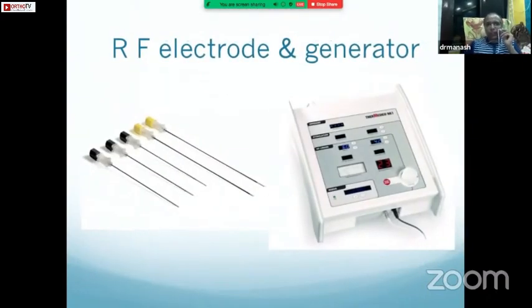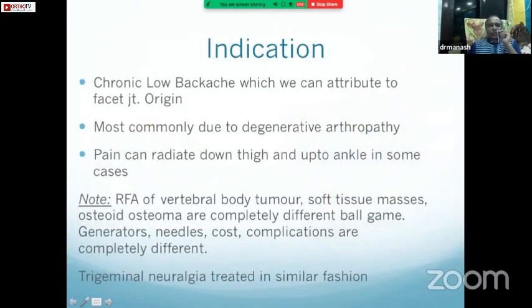So these are the normal needles for the radiofrequency ablations. These are either 22 or 20 gauge needles, and this is the generator. Indications, as already discussed, is chronic low back pain, which we can attribute to the facet joint origin, and most commonly due to degenerative arthropathy. So pain can radiate down up to the thigh, in some cases up to the ankle as well.